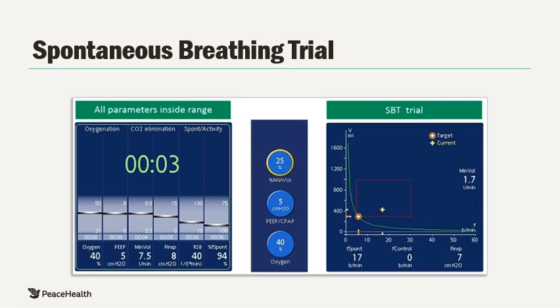In this situation, in order to fully prove the patient can successfully extubate on ASV, you have the option of either dropping the percent minute volume from 100 to 70% or dropping percent minute volume to 25% as shown on this screen. Please note that if you choose to drop the percent minute volume to 25%, the caregiver should then remain at the bedside. This is due to the minimum minute ventilation being 1.7 liters at 25% minute volume, which is not sufficient should the patient become apneic.